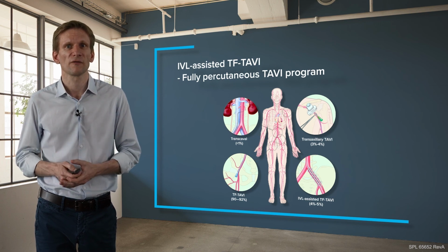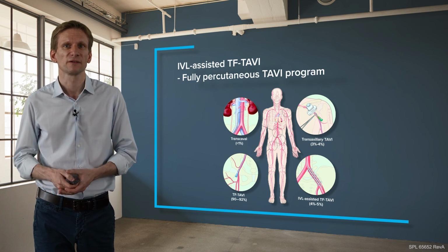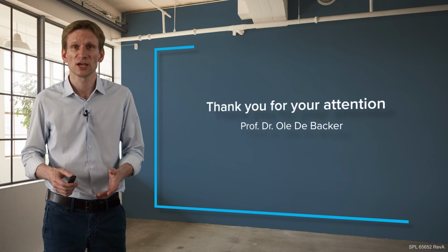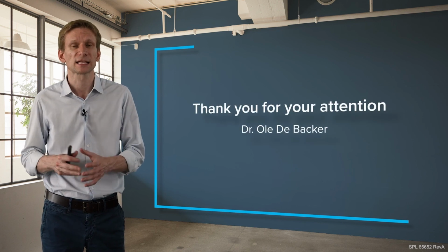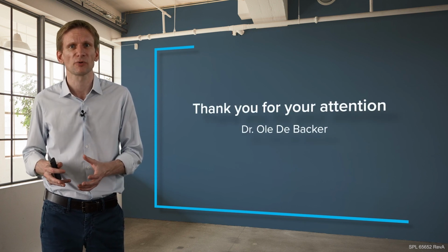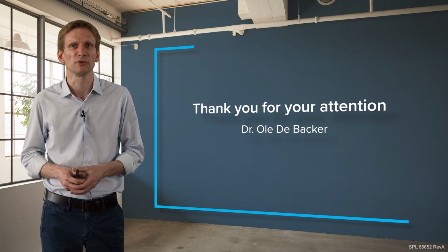So this is offering our patients a truly safe and effective therapy and TAVI program in our center. I hope you found this tutorial very educational and that these insights can help you in expanding your transfemoral TAVI program at your center and being able to offer the best possible treatment to your patients.